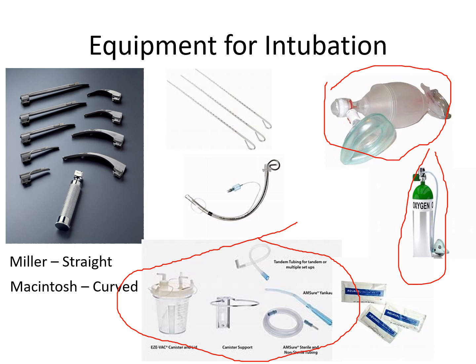You would need the tonsil suction, which is your Yankauer suctioning. You would need also a suction catheter, so that once the intubation has occurred, you can easily go down and suction any secretions that are spurting out.